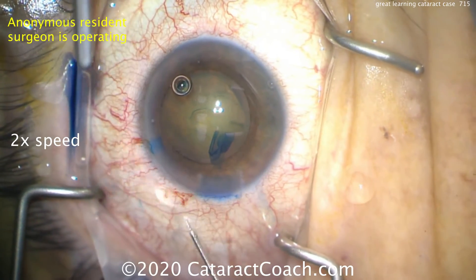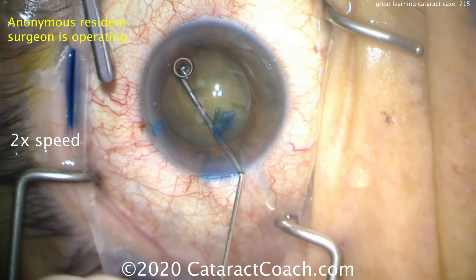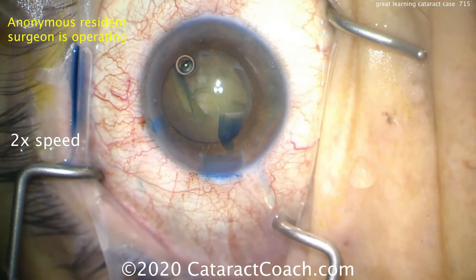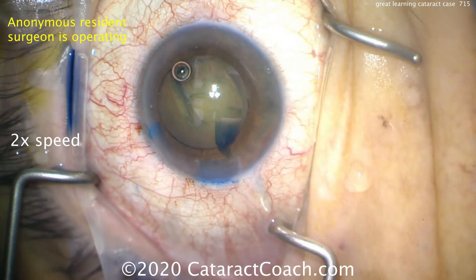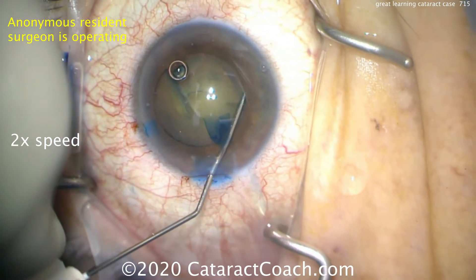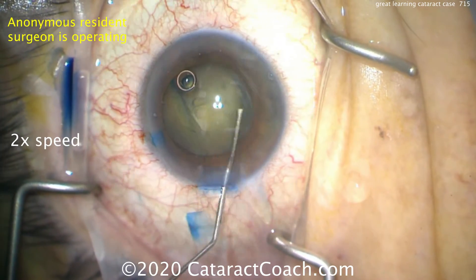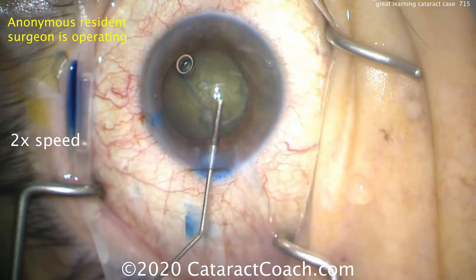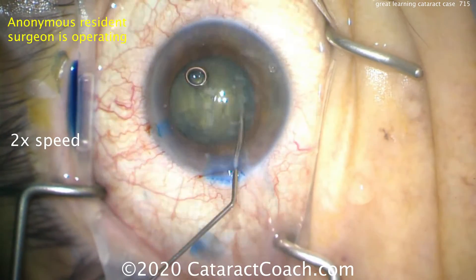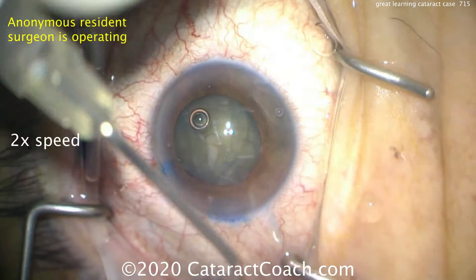Hydrodissection is key. You need a lot of fluid waves going here and need to make sure this nucleus can completely rotate. If it does not spin, you will not win — trust me on that. If you're going to do a technique such as divide and conquer or stop and chop, you need that nucleus to spin. Even chop maneuvers are better off with a spinning nucleus. Take your time doing enough hydrodissection, tap the center of the nucleus, make sure that fluid wave goes around. The nuclear density in this lens is pretty good, maybe about three-plus nuclear sclerosis. And there's a good rotation — once it rotates like this, we know we're in good shape.